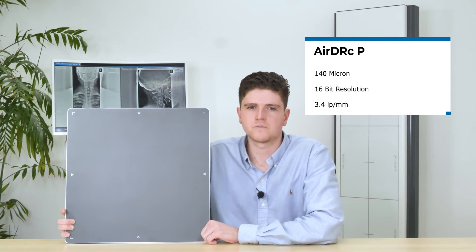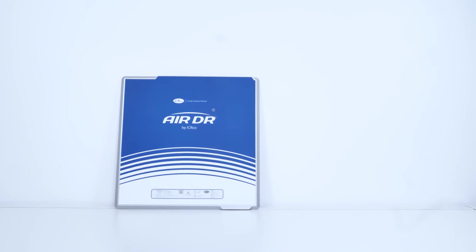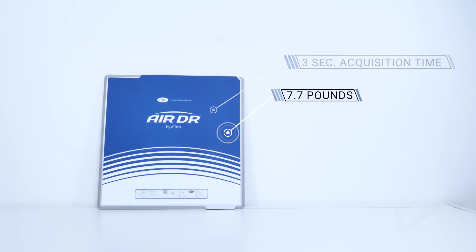Our AirDRCP model comes with 140 micron 16-bit resolution with a spatial resolution of 3.4 line pairs per millimeter. It also shares the same 3 second acquisition time as the AirDRP, yet weighs just 7.7 pounds.